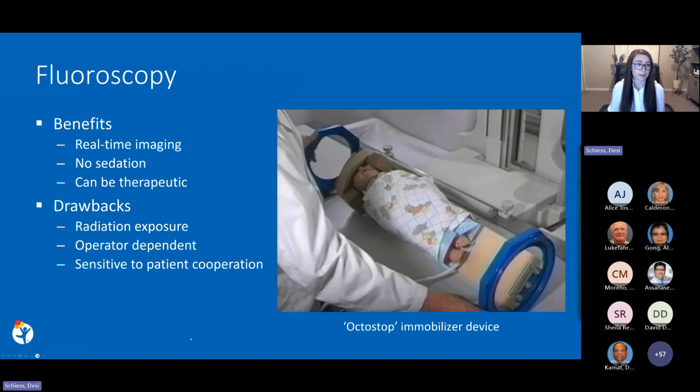Moving on to fluoroscopy. This is a device that's still used at some children's hospitals for fluoroscopy in infants. The baby is strapped to the board at the head and around the legs, and this device can be rotated to position the patient at any 45-degree angle to obtain images in frontal, lateral, or oblique views. The X-ray source is above the patient, and the detector is below the table.